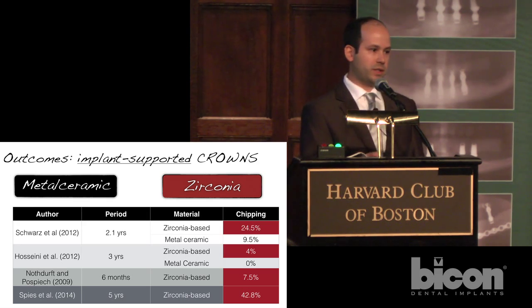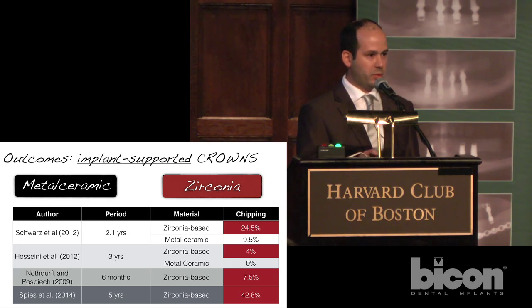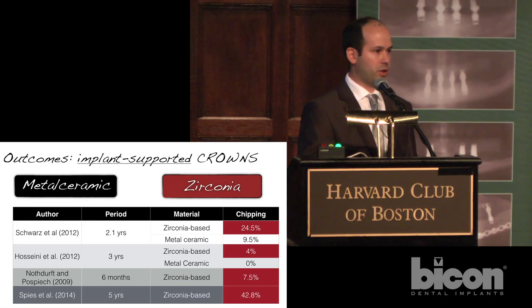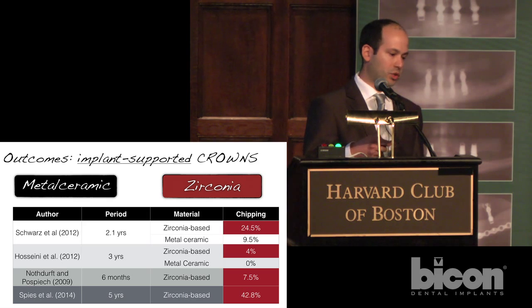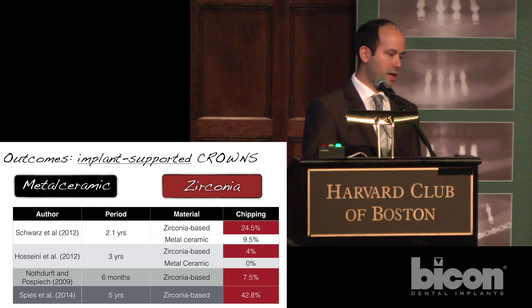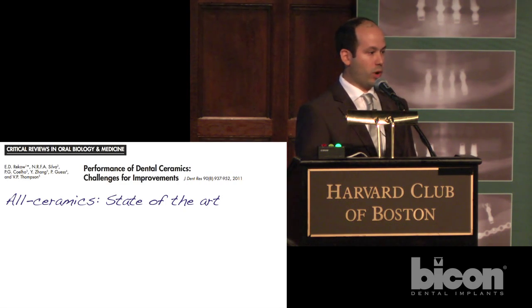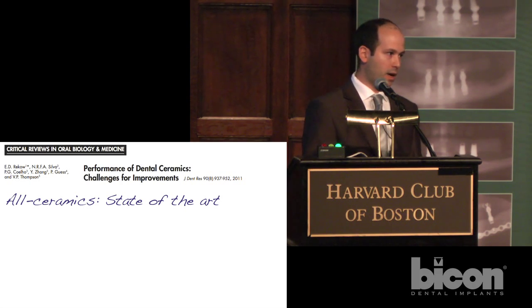And believe it or not, there's just one main zirconia supplier in the world. Of course, they're differently manipulated by the different companies. But there are other problems involved in terms of handling and so forth. So it's not as easy as that. It's strong. We know that the framework rarely fractures, but we're seeing an amount of complications which are just unacceptable. So if one asks today, what is the state of the art of all ceramic materials for implant dentistry, we must acknowledge we have problems to solve, all right?